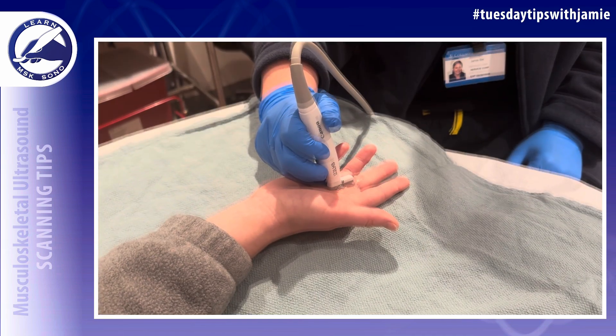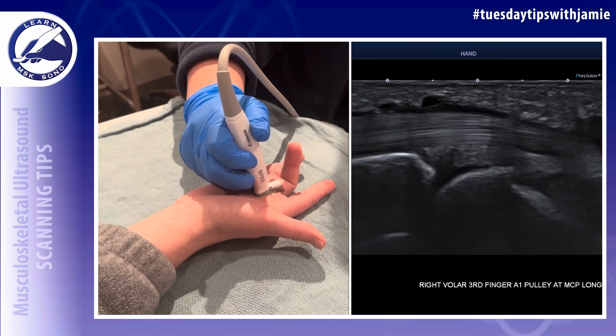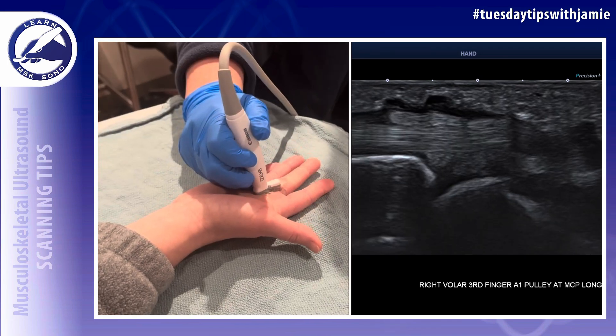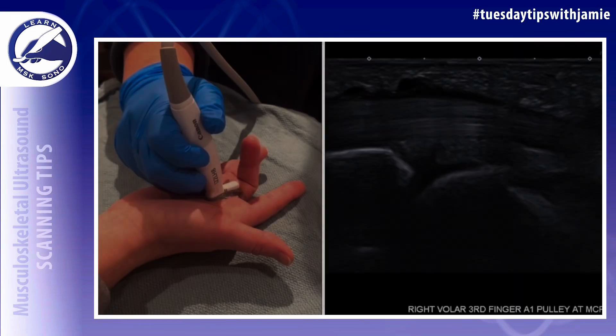In the second example, I had the patient perform the finger flexion themselves, and it was clear that there was locking up of the superficially located FDS tendon that was not visible when I had forced the finger flexion myself. It's good to try both ways to get a full picture of the situation.